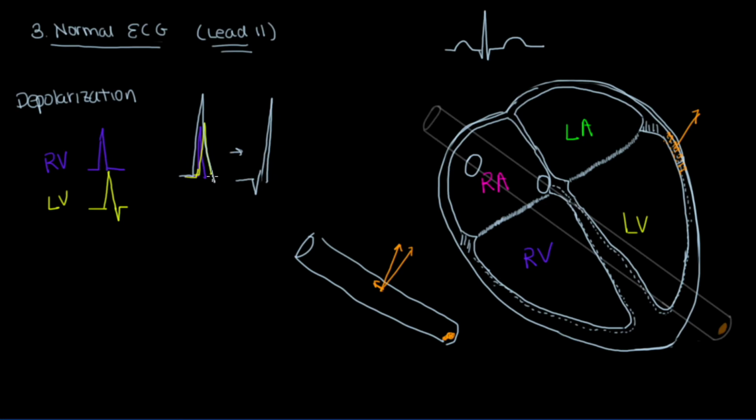So if we were to add that onto this diagram here, you got the right ventricle continuing to just be there. The left ventricle, after it comes down, it goes down a little further, then back up here. So the overall thing that the ECG shows is a little bit of a blip down here and then back up like this, thus explaining that little blip there.